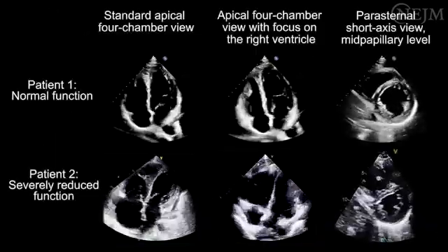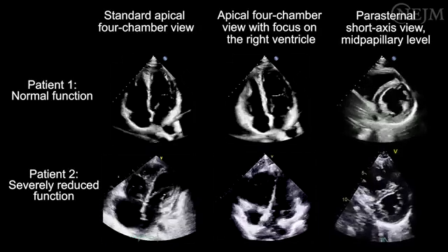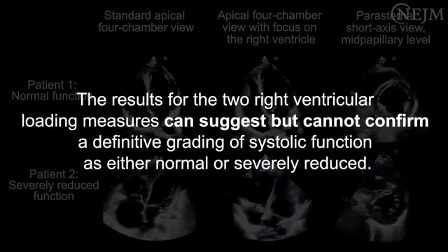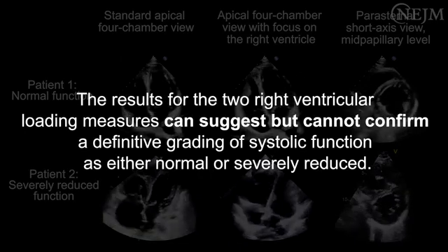As you perform the echocardiographic evaluation, it is essential to correlate and integrate the information collected in each view to complete the assessment of each measure. The results for the two right ventricular loading measures can suggest, but cannot confirm, a definitive grading of systolic function as either normal or severely reduced.